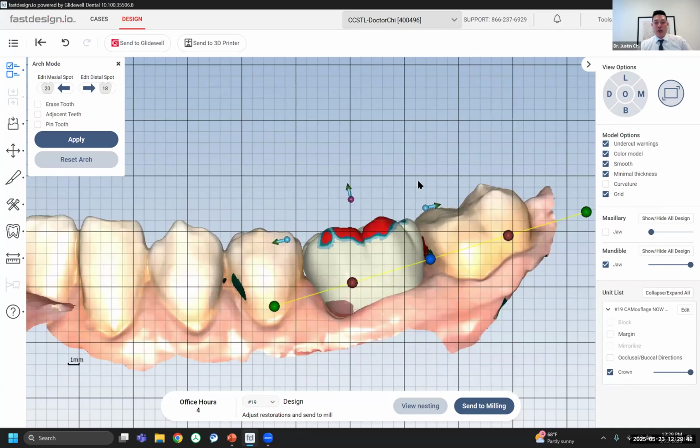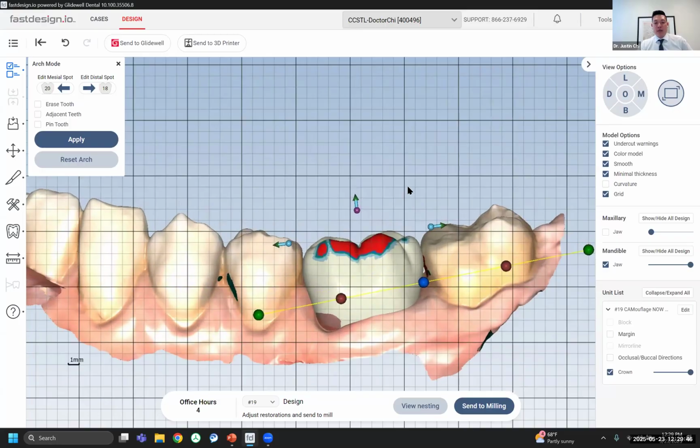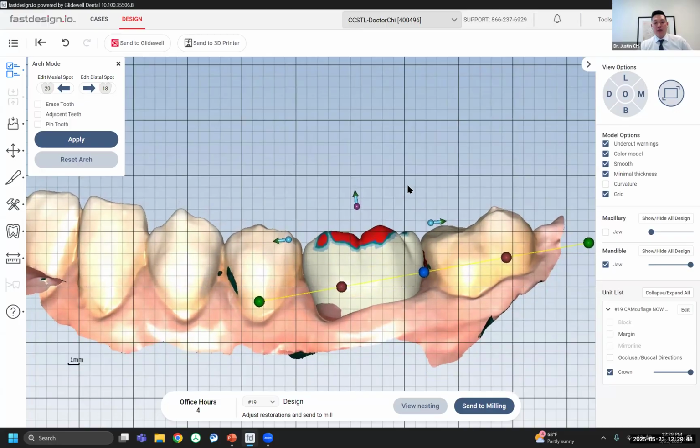So if we're taking an imaginary line from mesial to distal, we want the occlusal plane of the tooth we're working on to generally be kind of straight across. Maybe more so something like this. I'm going to angle this a little bit more vertically. So that's now the new long axis angulation, along this plane.